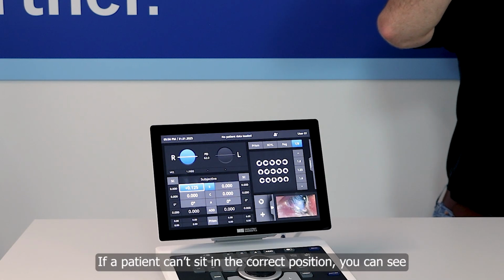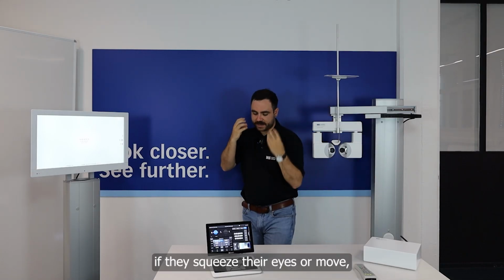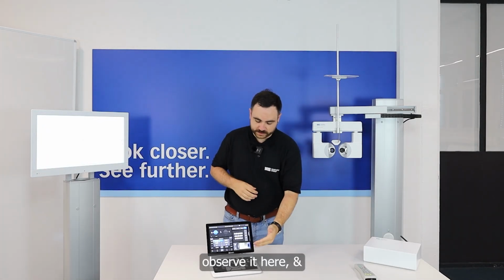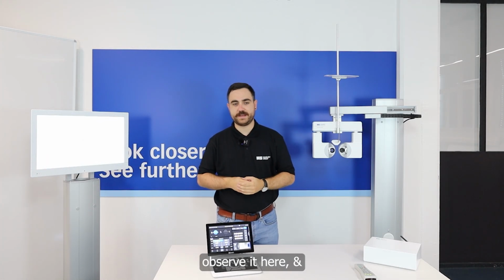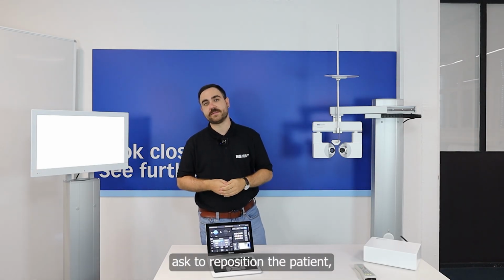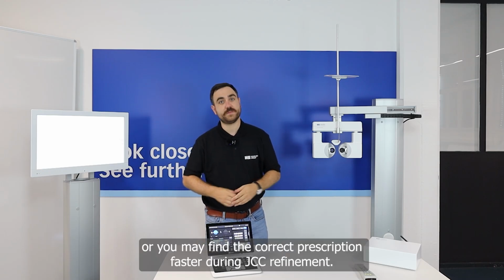So if a patient is not able to sit in the correct position, or if he presses his eyes or does something with them, then you could see it here and can observe it, and maybe you can delegate to bring the patient again in the correct position, or you find a little bit faster your correct prescription for the cross-cylinder mode.